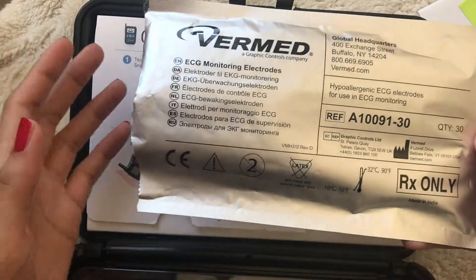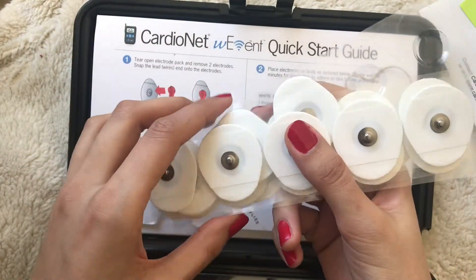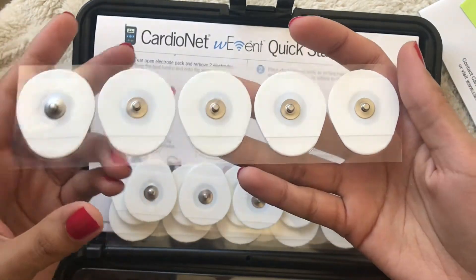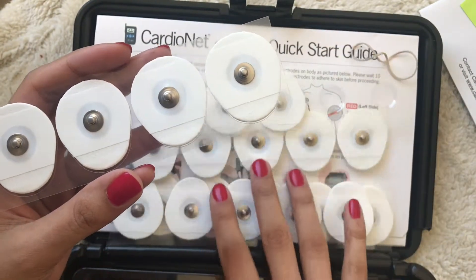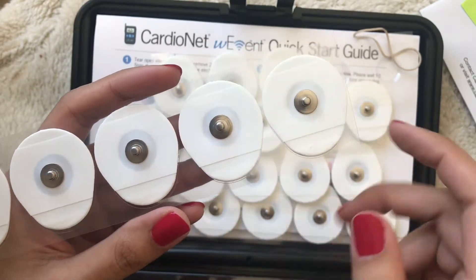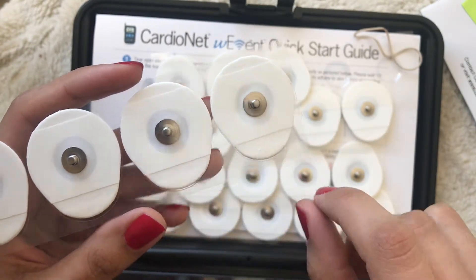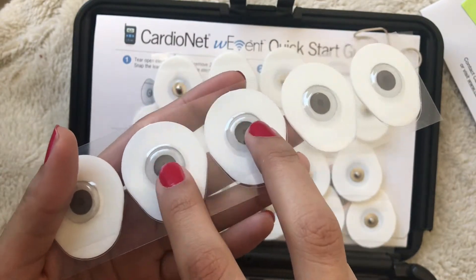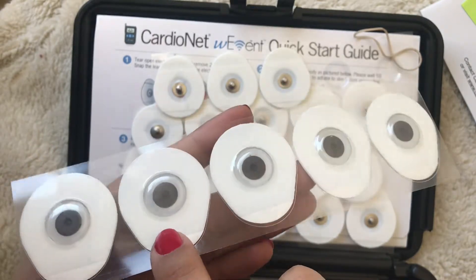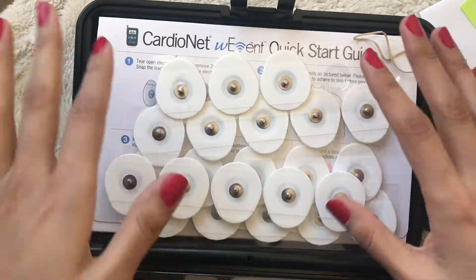Lastly we have the ECG electrodes. This specific Holter monitor can record for up to 30 days, so depending on how long your cardiologist recommends wearing it, they give you enough electrodes for the full 30-day period. You have to change out the electrodes every two to three days to prevent skin breakdown. This is the front part of the electrode — the metal part is where we place the leads. On the back there's a gel-like pad where the electrical activity is transmitted through, and this is the sticker placed directly onto the skin.